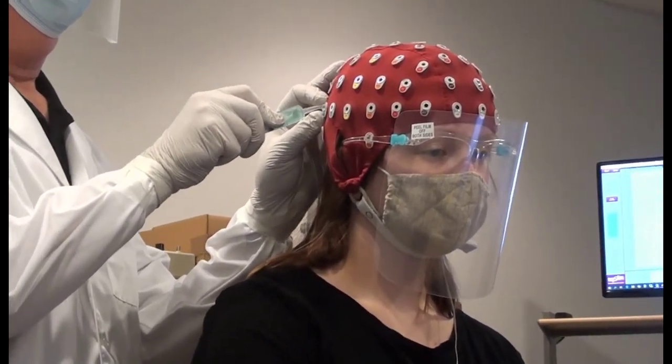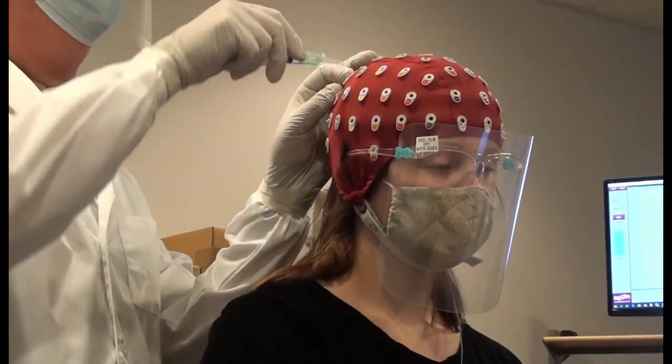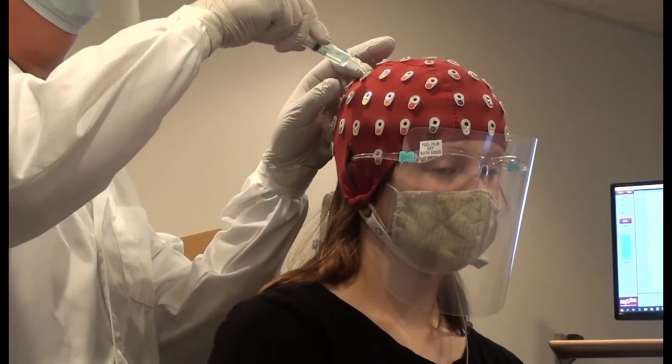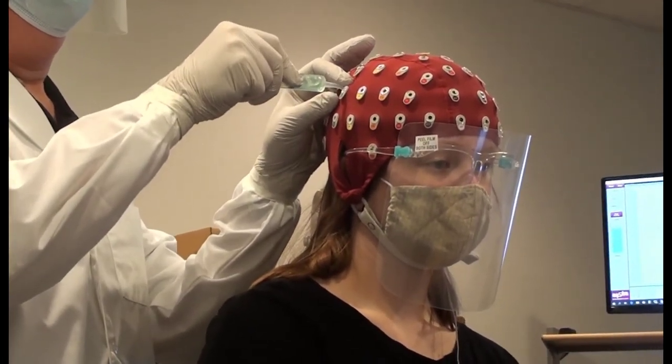DRL itself needs slightly better contact than the other electrodes to do its job. Be sure to part the hair at DRL and inject enough gel that the participant feels it, but not so much that a bridge could form with an adjacent site.